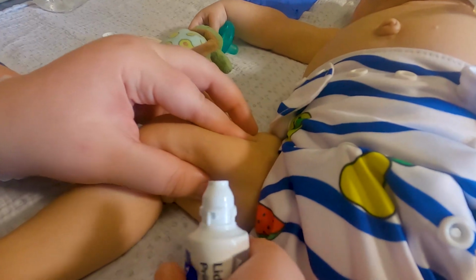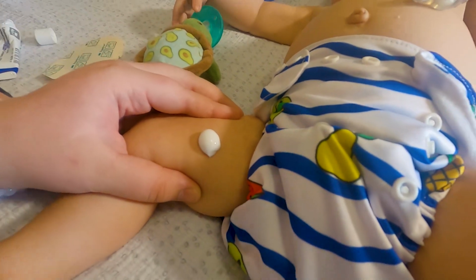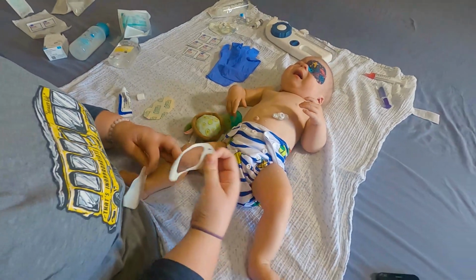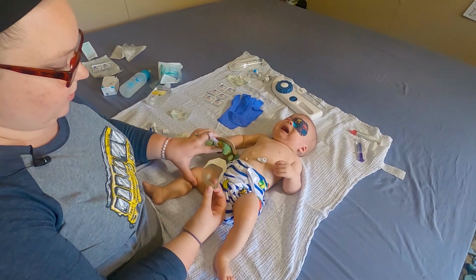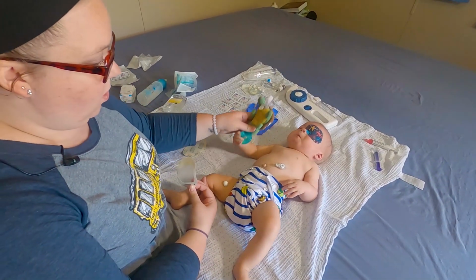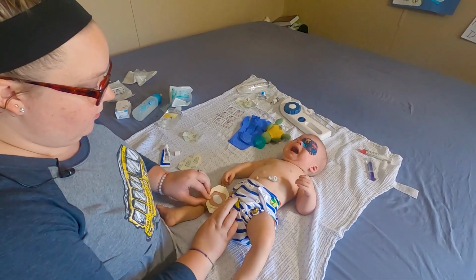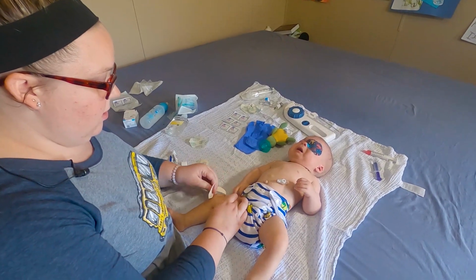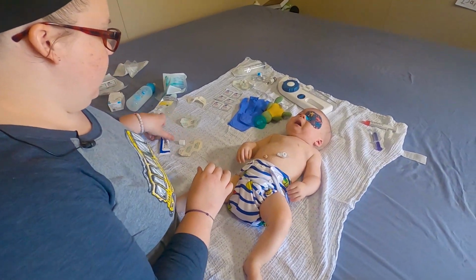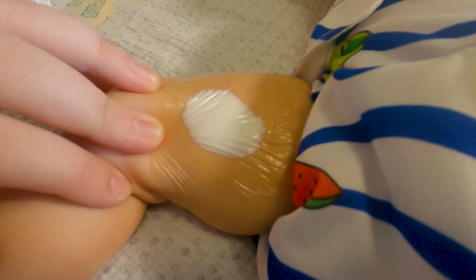We're going to get his fatty part right here. And I'm a little generous with our lidocaine cream because I don't want him to feel it. Yeah, he knows what's happening. Get that out of the way, buddy. Then we just put it on there and I just kind of rub it around for a second. And we do that. So that's what it looks like when it's done.